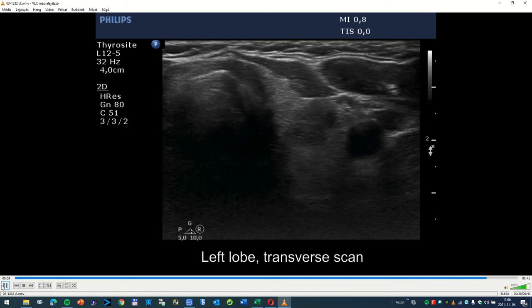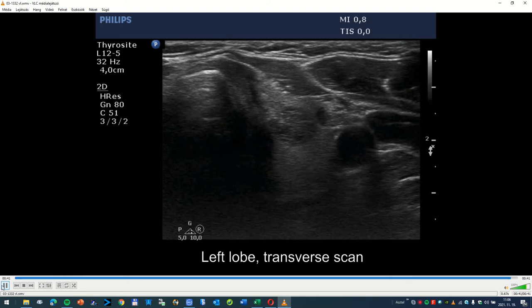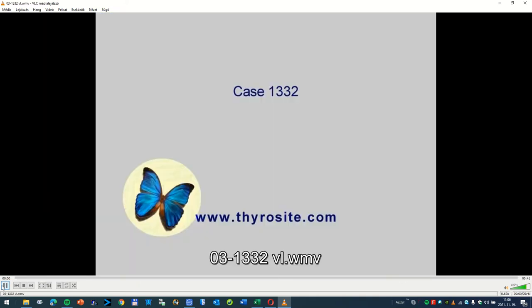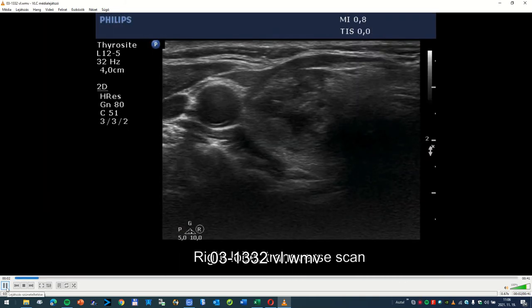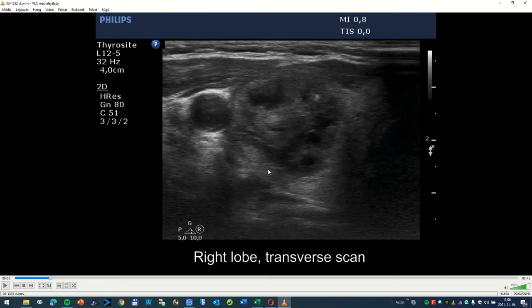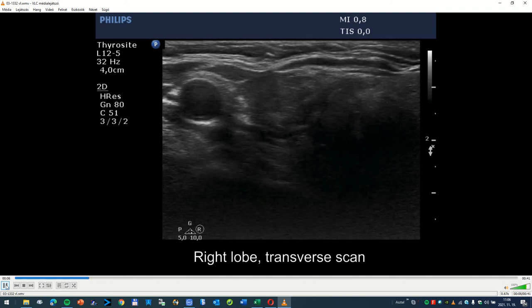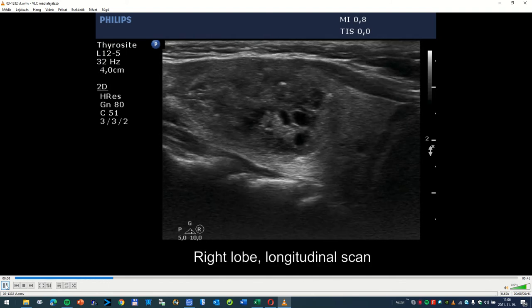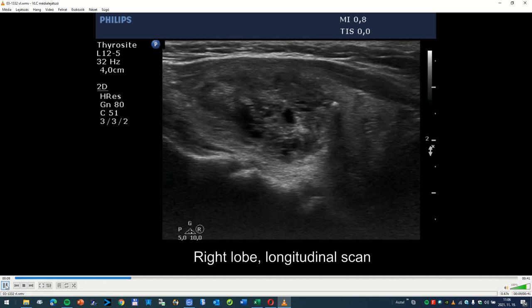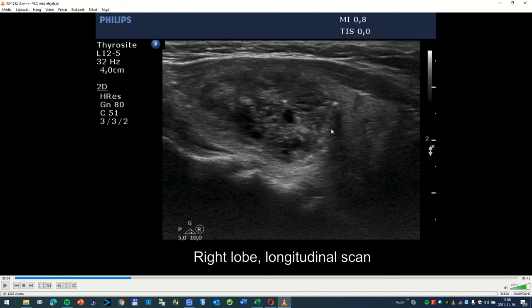The left lobe also had several cystic or partially cystic lesions. Finally, this nodule has moderately hypoechoic echogenicity. According to all TIRADS systems, this nodule is a candidate for cytology because it exceeds 2 cm in maximum diameter. We have some concerns about these figures, but irrespectively of our concern, this nodule has to be aspirated.